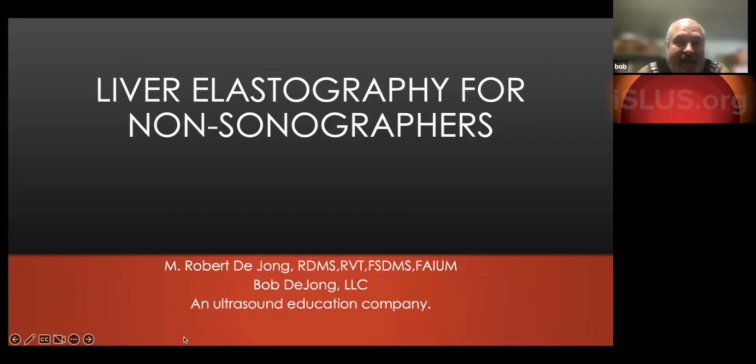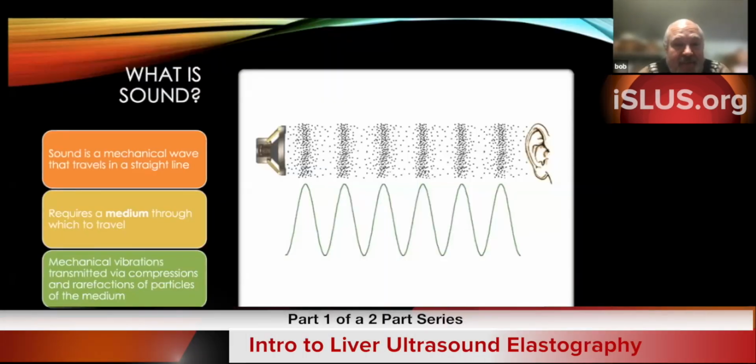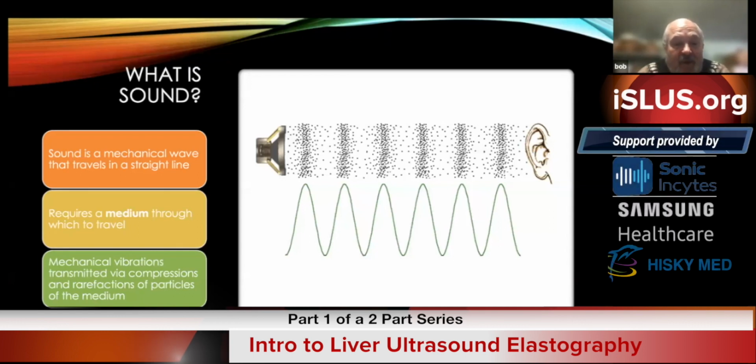So I call this liver elastography for non-sonographers. We're going to start at the very beginning so we can understand what's going on here in the body with sound waves. Sound is a mechanical wave that travels in a straight line. You can see right here.